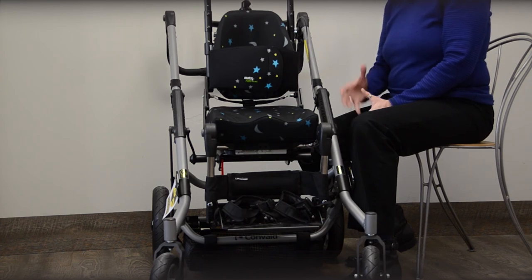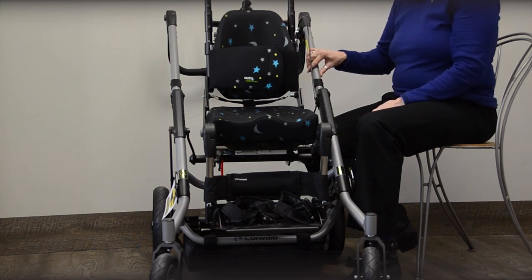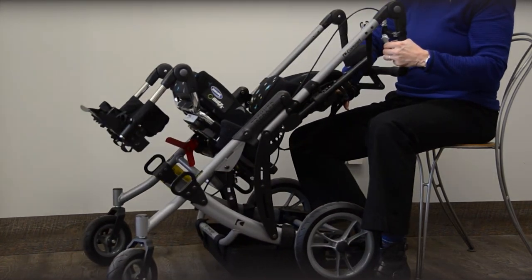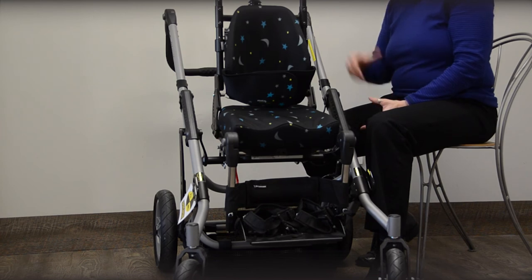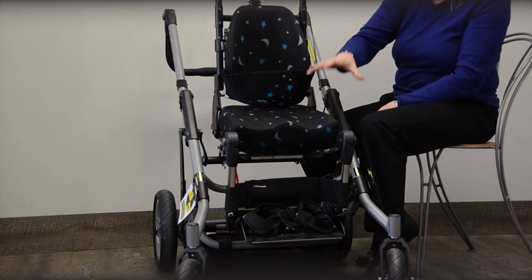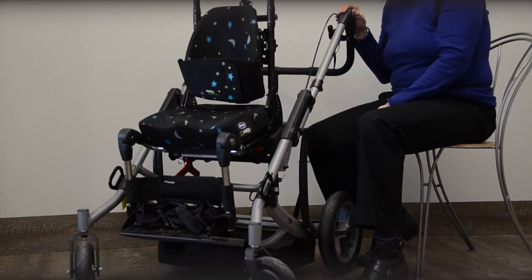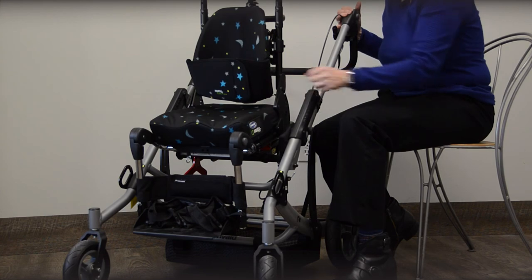Another great application for the Matrix Mini back is on a stroller — this is a Convaid Trekker, but any stroller that uses round back canes is easily compatible with our hardware. This shows an example on a stroller that allows tilt, and it is a system that can be collapsed and transported in a car. Our quick-release Mini-Set hardware works easily in that configuration, providing a back support with more lateral support and stability, the option for our anterior Mini Flex, and it is shown here with one of our pediatric-size Matrix cushions using the Kadabra fabric on a mini-size PS cushion.